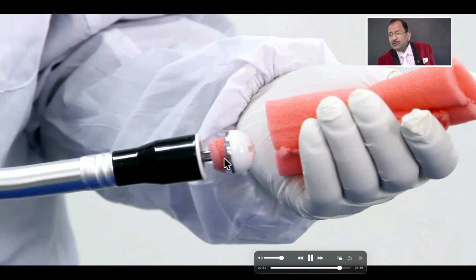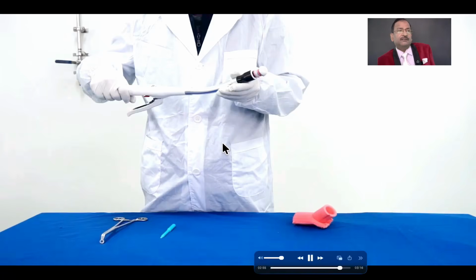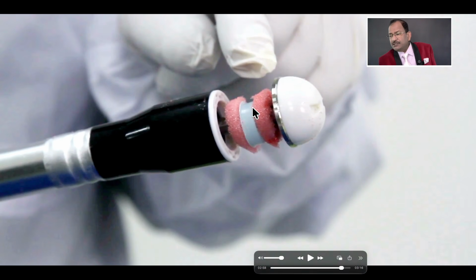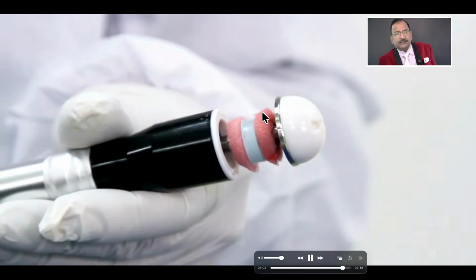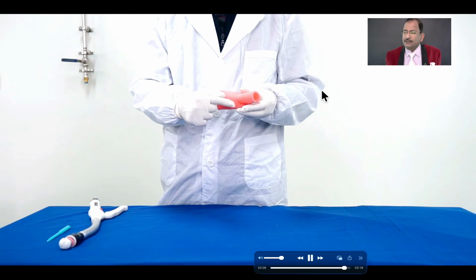And both the donuts should be inspected, that these donuts should not be half circle. If it is half circle, that means it can leak. That means this donut should be a correct 360-degree donut. Otherwise, you have to take a suture. And then you should do a flat tire test.